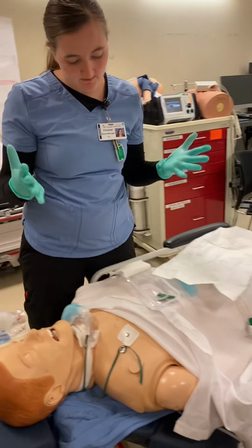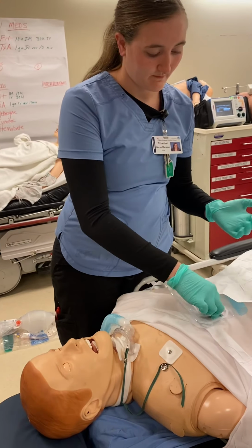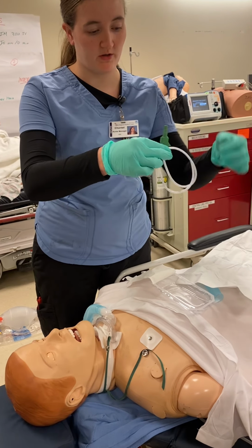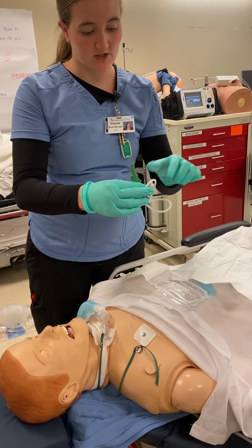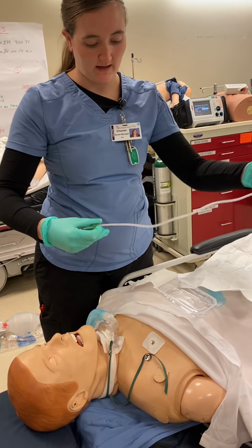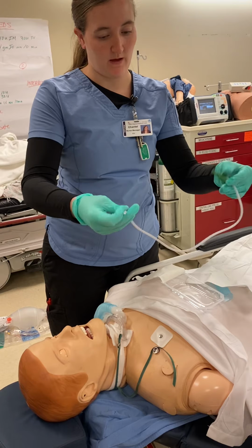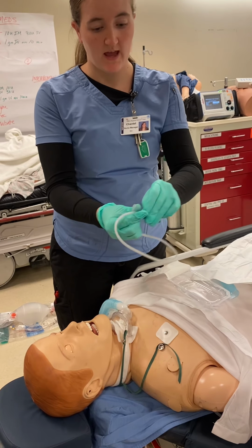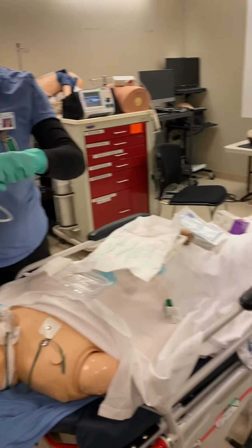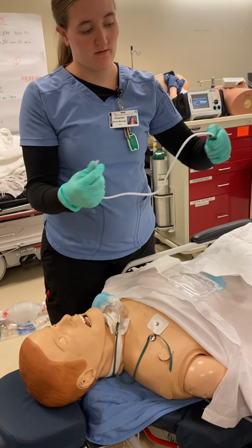Okay, with my sterile gloves on, you're gonna have this that you can kind of hold and maneuver. Once you start suctioning, one hand will become dirty, so be mindful of that. So what I like to do, so it's not flopping all over the place, is hold this end and then hold here. I'm gonna grab, now this hand is dirty, my suction and connect it, okay? So now this is dirty.